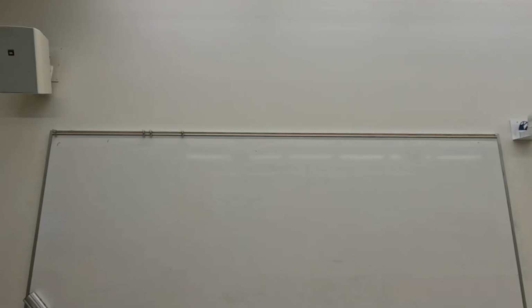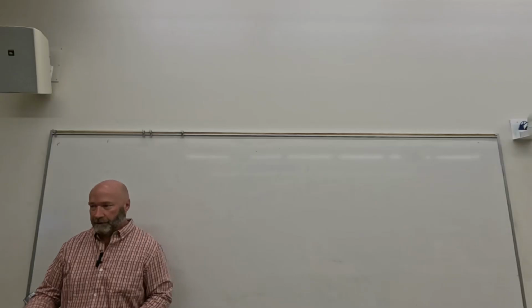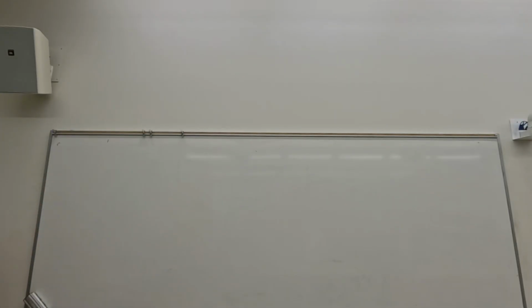All right. So again, we've got two different types of X-ray rooms. We've got general purpose room. General purpose room we generally refer to as RF room. So RF room is radiography and fluoroscopy. So you can do any exam type in those rooms within reason. We can't really do, we used to, but we don't anymore, things like cardiac catheterization or anything like that. That has evolved to the point where we need specialized equipment. It's usually going to be a C-arm type setup. So RF room is going to be a diagnostic room. It's not going to be a special procedures or a cardiac catheterization room.